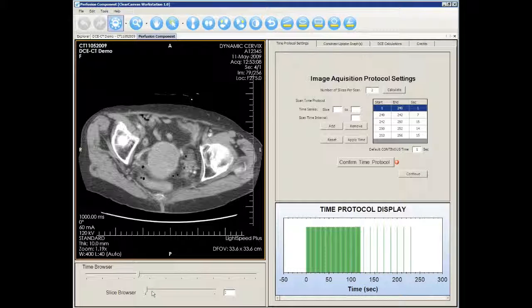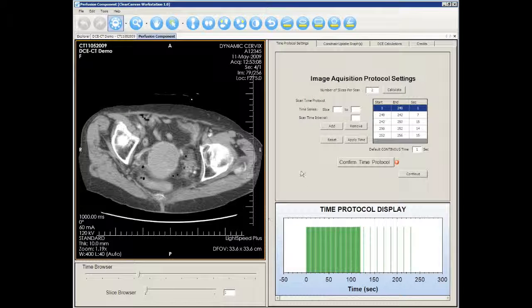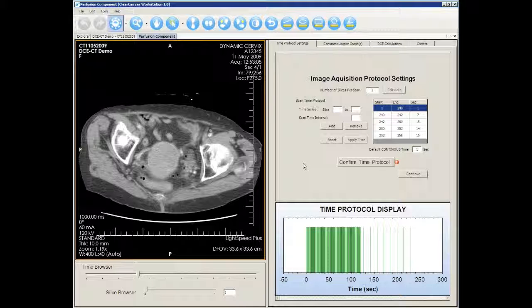The DCE Tool automatically detects the image acquisition protocol. However, you can change the settings yourself. For example, for this dataset, slices 240 to 242 are acquired at an 8 second interval rather than 7.